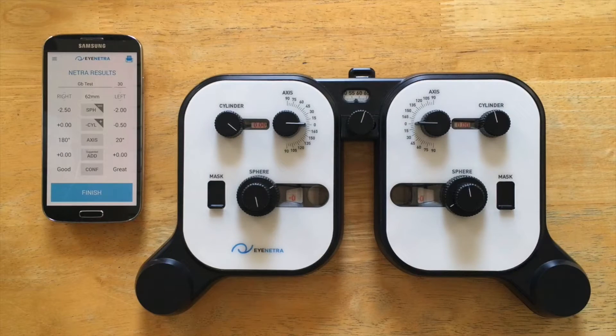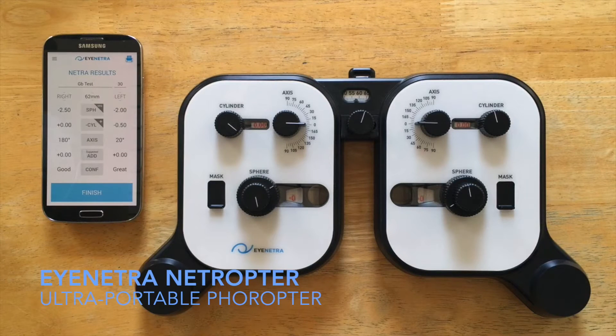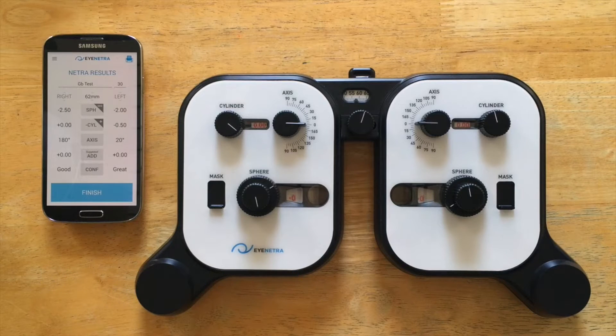Hello everyone, Greg here from EyeNetra and today we're going to take a look at EyeNetra's Netropter, an ultra-portable, lightweight, handheld phoropter. The Netropter is designed to be used as a verification and refinement tool for all the measurements gathered from your EyeNetra autorefractor.